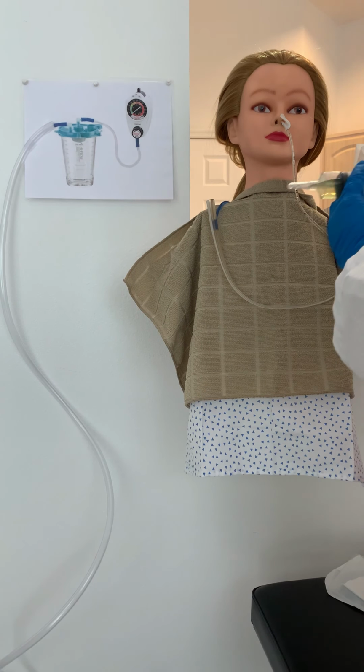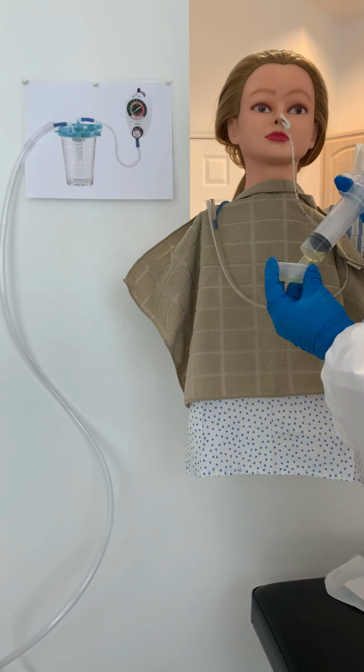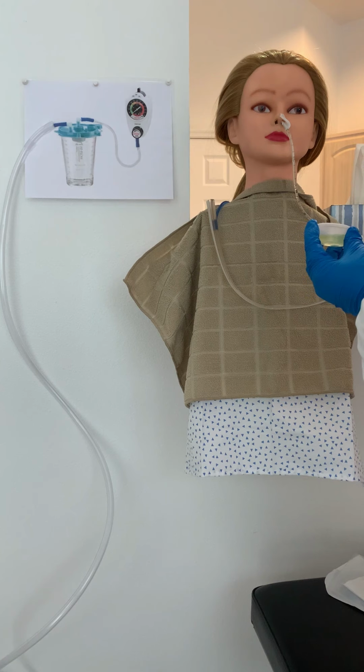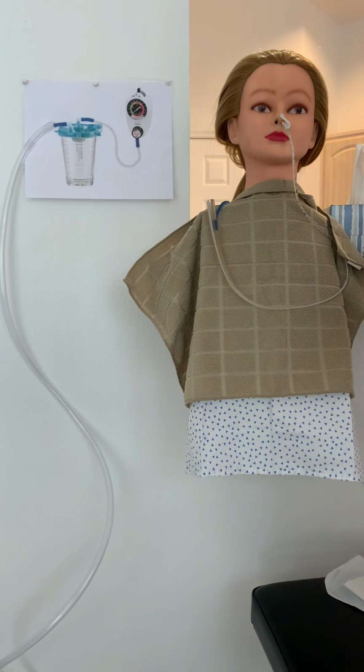So then I'm going to take this fluid that I drew out and I'm going to put it into this cup, the little medicine cup. And I will use a pH strip to test it. So we just dip that in there for a couple seconds. And then we can compare against our chart here.